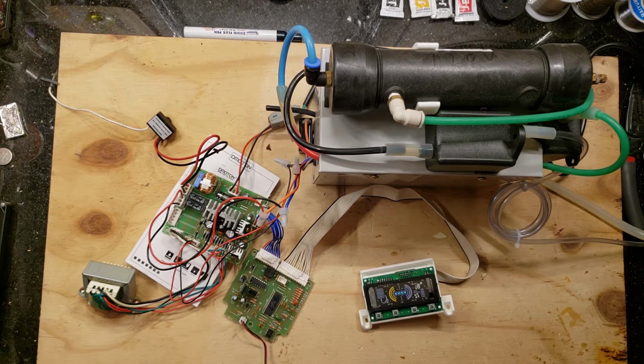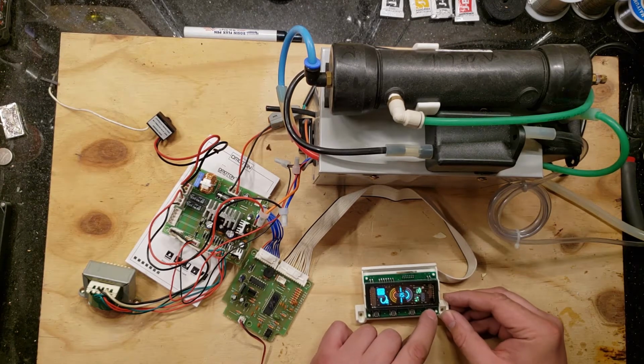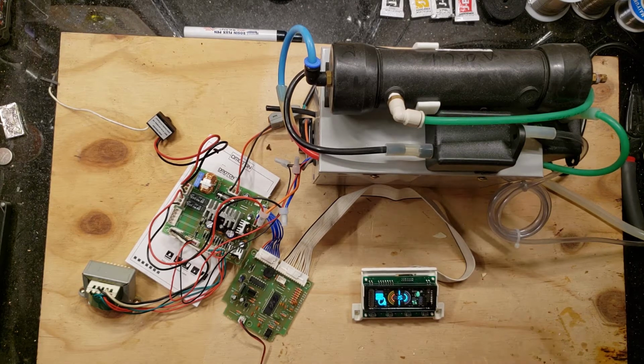So let's turn this on. We got 5 minutes. Oh, there you go. That sounds different now. 10 minutes, 15 minutes. See, the timer now doesn't do anything. Oh, it switches between manual and auto. The power doesn't do anything, and then the ion turns on that little contraption, which I'm going to keep off.